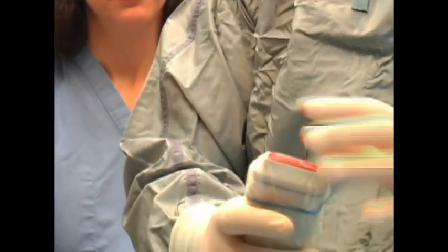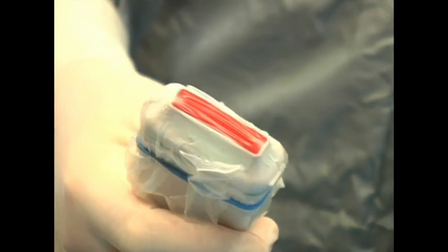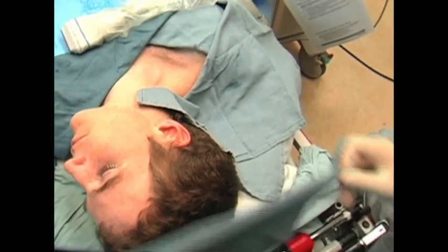He'll smooth out the gel underneath the sleeve, and then he can apply the sterile gel to the top of the transducer. Or he can wait and do this when he's ready for the procedure. And now we can actually lay the transducer on the sterile field. Now Dan is back in position at the head of the bed.